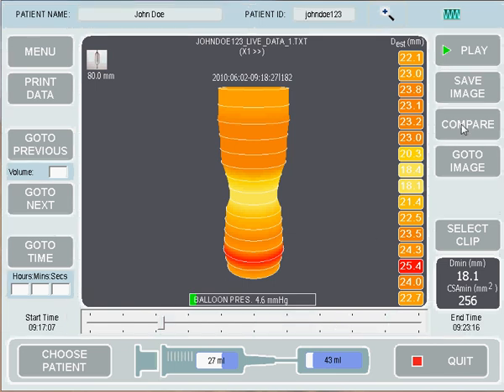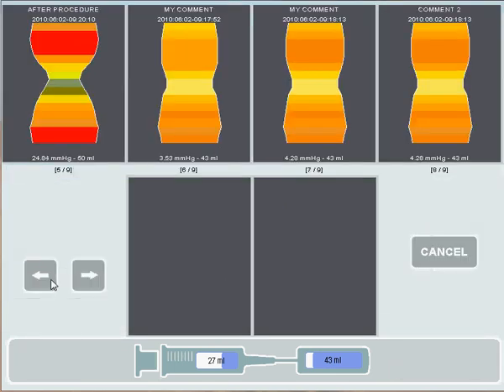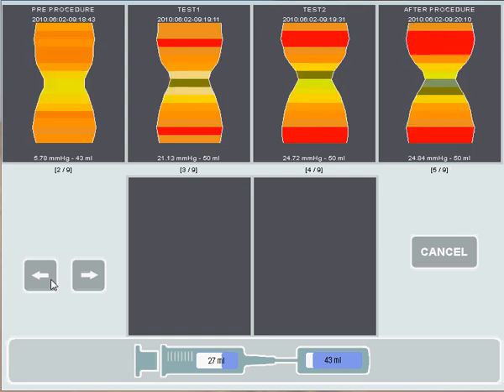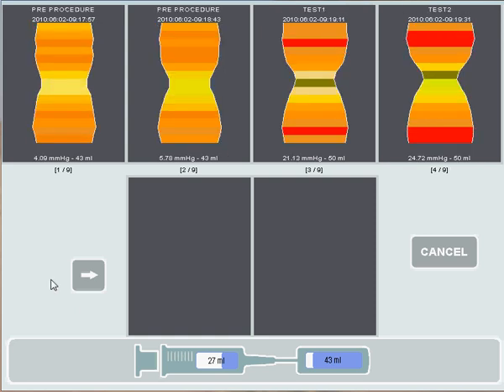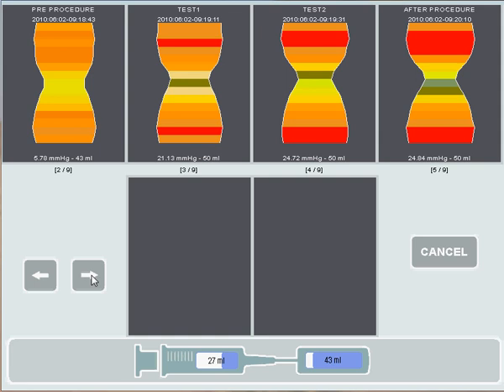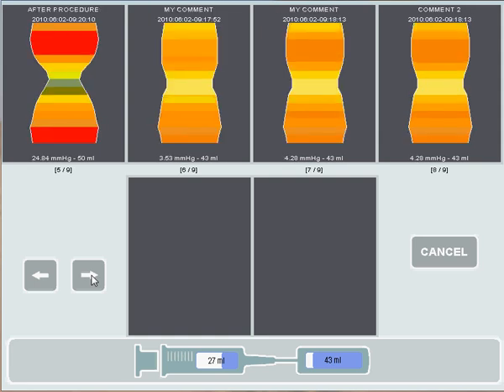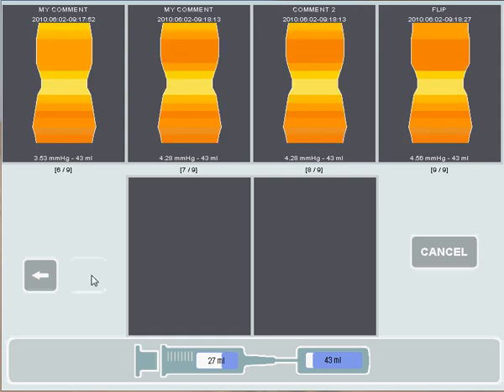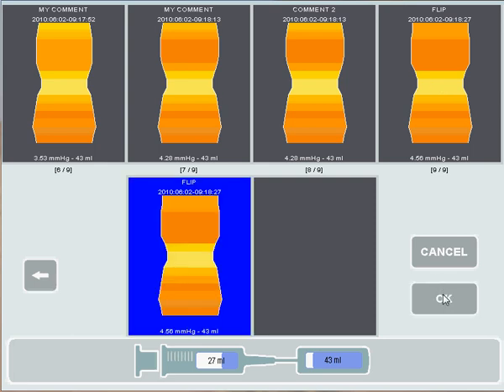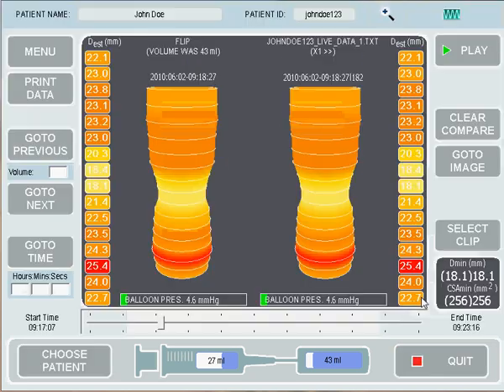If you go into Compare Image, using the open back arrows you'll see that we've got a few snapshots saved. The first snapshots were used during the procedure, and then you'll see that our 'flip' comment is here. We press on the image that we'd like to compare and press OK. If we select just one image, it will compare that image with a live image — so we've got our snapshot and our live image.